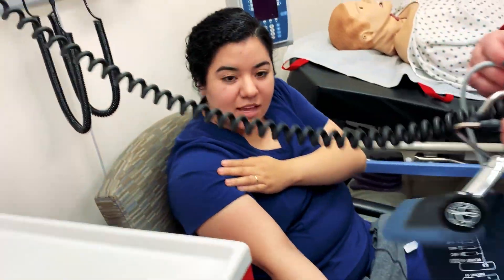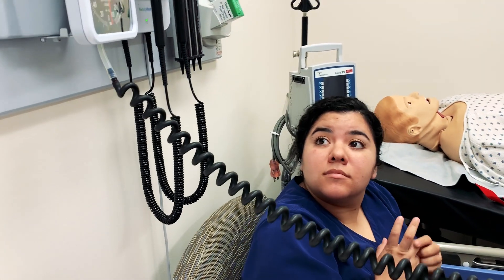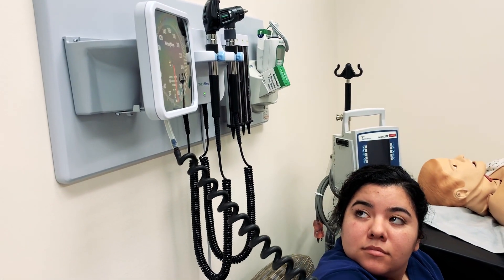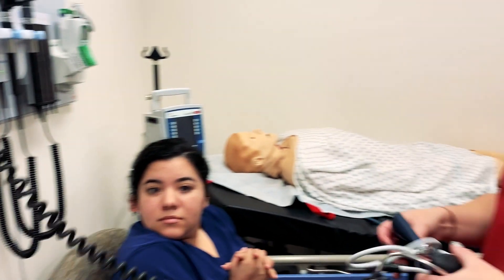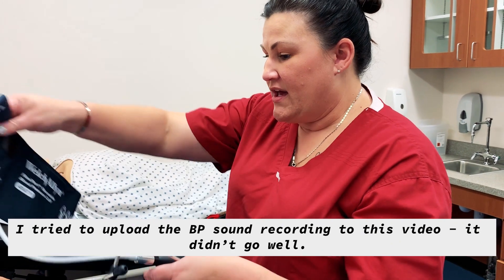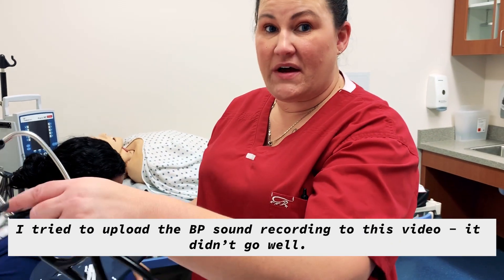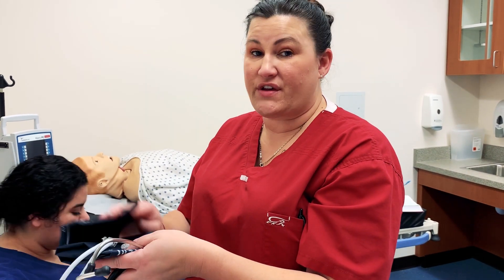You may have been able, while watching the dial, to see it jump a little bit — that's normal while you're watching the dial, but you do not want to rely on that as an indicator for blood pressure. You always want to make sure that you are only recording blood pressure measurements with the numbers that you have actually heard.